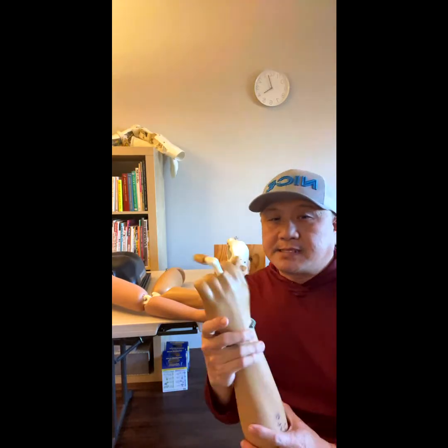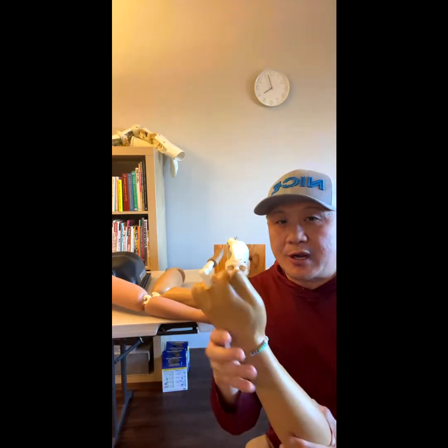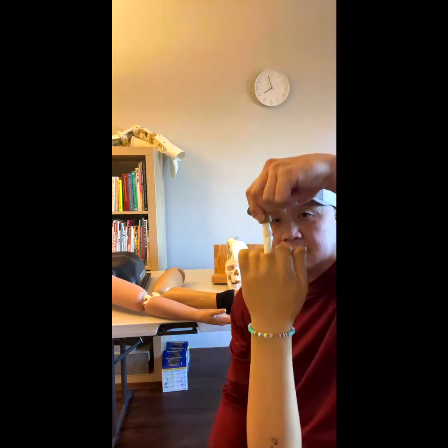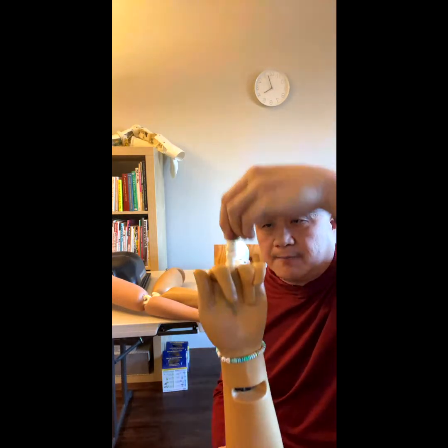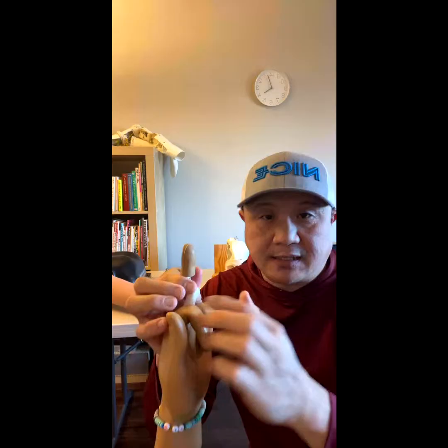So this is the joint dislocation reduction technique task trainer. Let's say finger — playing basketball and the ball hits this part, and then this bone comes on top like that. This happens to the other fingers too, but this is the most common finger.